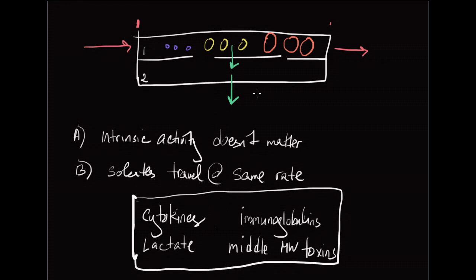This is very similar to what's happening in the native kidney and the transplant kidney. Unfortunately, if you replicate this in a dialysis machine, despite it being very similar to what's happening in the glomerulus, you don't get any extra mortality benefit. But it's a very easy process to undertake, and it's very physiologic in the sense that a lot of what's happening in pushing fluid and solutes across one compartment to another is exactly what's happening in the native kidney.